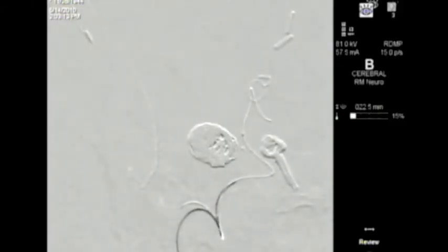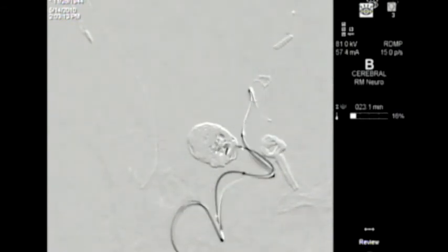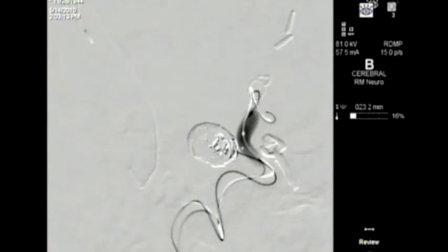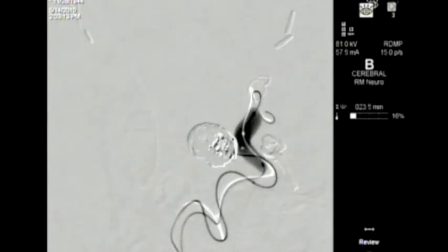Here we can see another platinum coil coming up through the microcatheter delivering into the aneurysm dome. The balloon is inflated across the neck of the aneurysm again. This soft platinum coil goes inside the remaining open spaces within the aneurysm which show up as black in the otherwise silver appearance of the aneurysm coil mass.